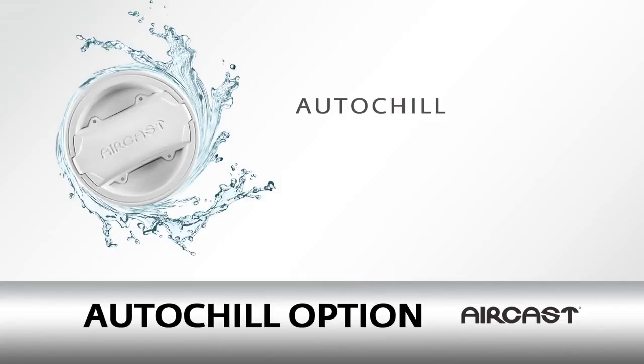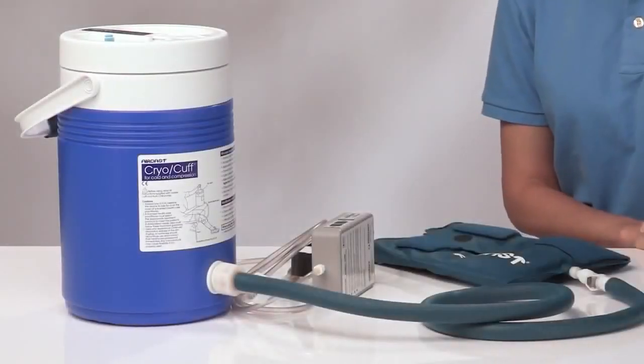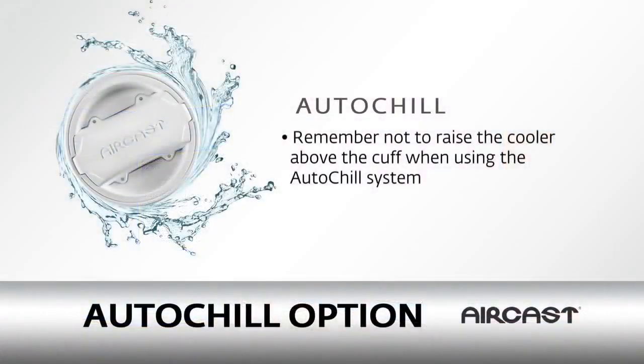Re-chilling your water is easy with the auto-chill, which automatically exchanges water from the cooler to the Aircast cryo-cuff. To use the auto-chill, place the cooler on a bed or table, keeping the base of the cooler even with the bottom of the cuff. Remember not to raise the cooler above the cuff when using the auto-chill system.